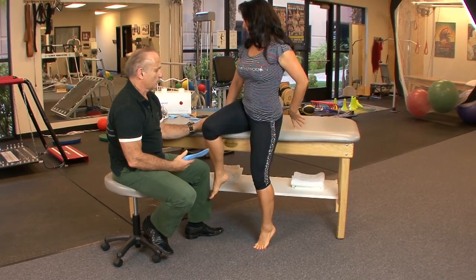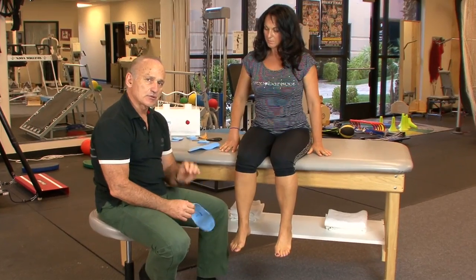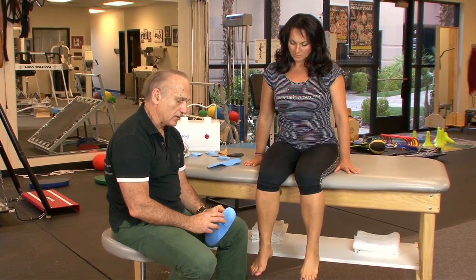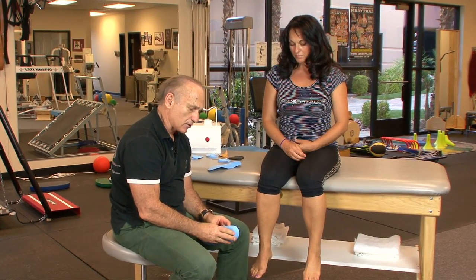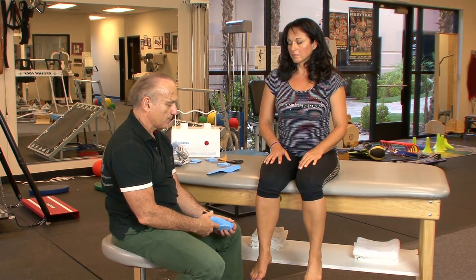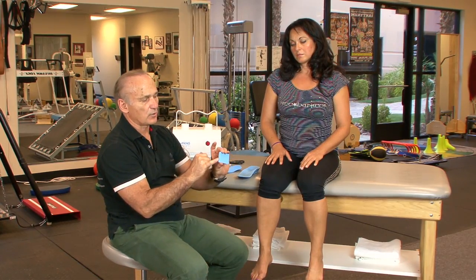Now we'll demonstrate the forefoot post. Sometimes I go with just the orthotic itself, but for her with a pretty collapsed, over-pronating foot I would definitely add a rear foot post to start. What I love about this product is I can start with a rear foot post, heat them, she wears them, comes back in a week or ten days — if pain is mostly gone, maybe then I add a forefoot post.